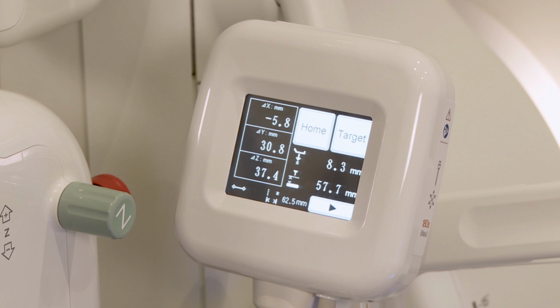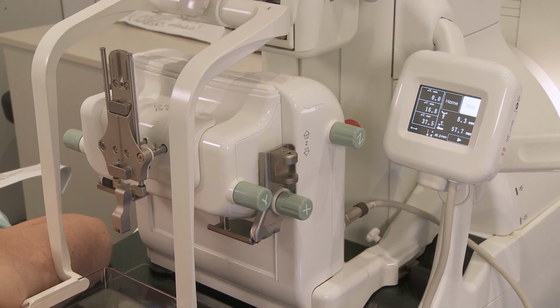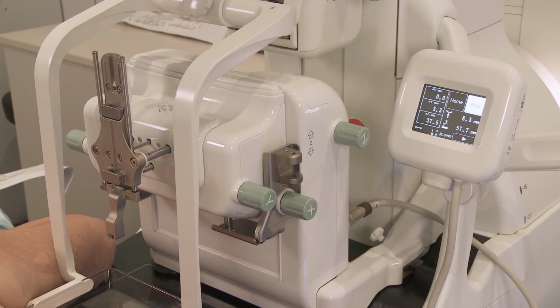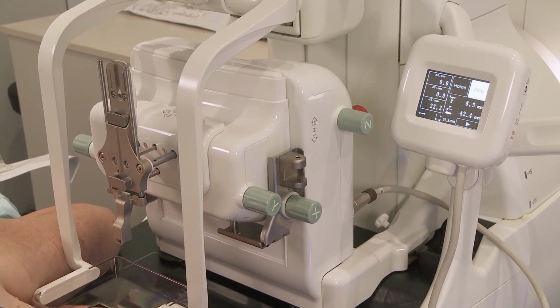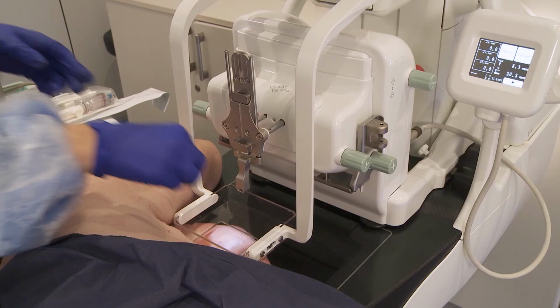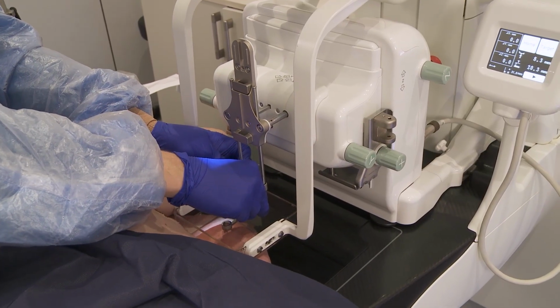The target information is displayed. Press the target button to drive the needle holder to the selected target coordinates. Insert the Fuji needle guide holder and lower it down.